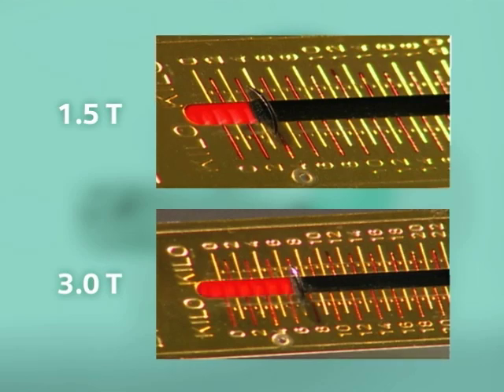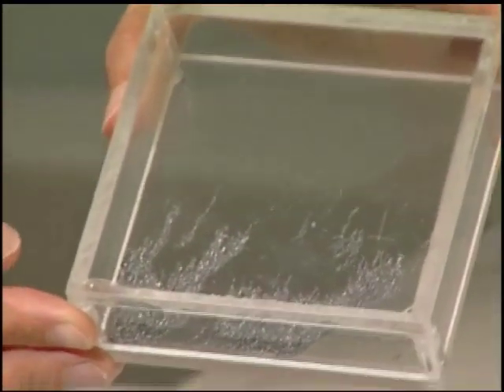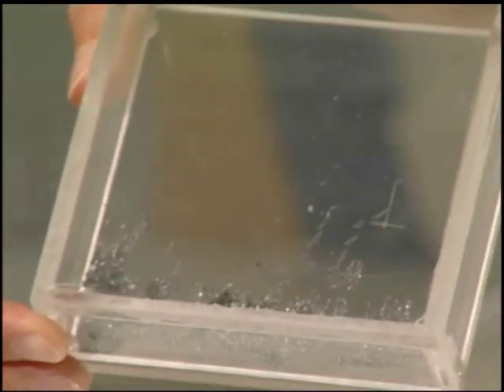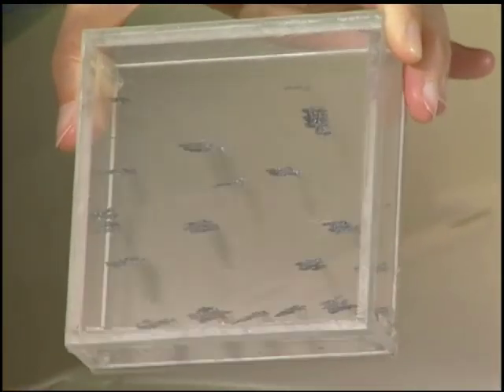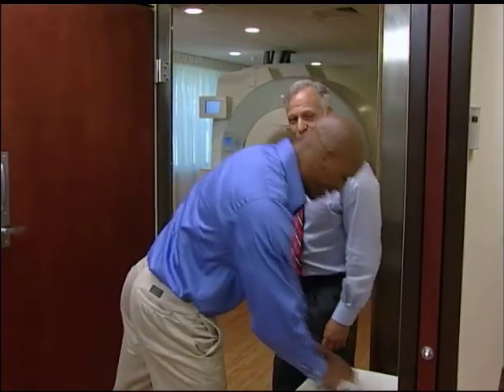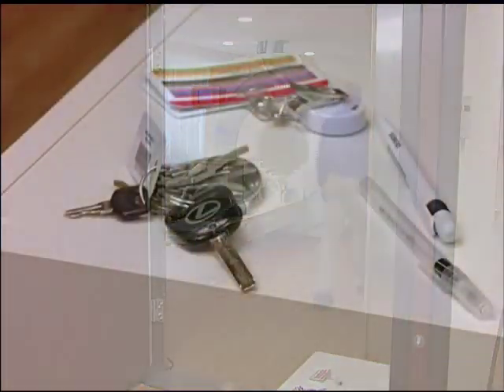Magnetic fields from MRI systems are not directly perceptible, and their dangers are often underestimated. They exert an enormous attractive force on magnetic objects and objects containing magnetizable material. Can you imagine approaching the magnet with a set of keys in your pocket? Or forgetting to remove change, your lighter, or your pocket knife? And what about the dressing scissors?